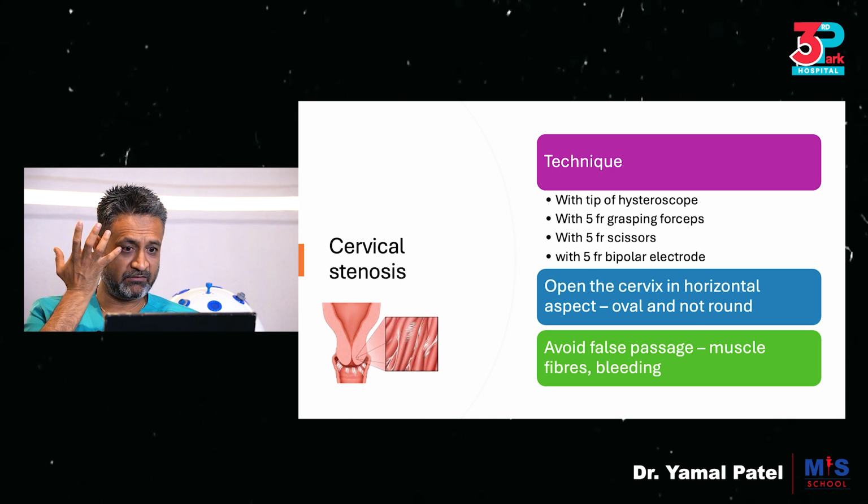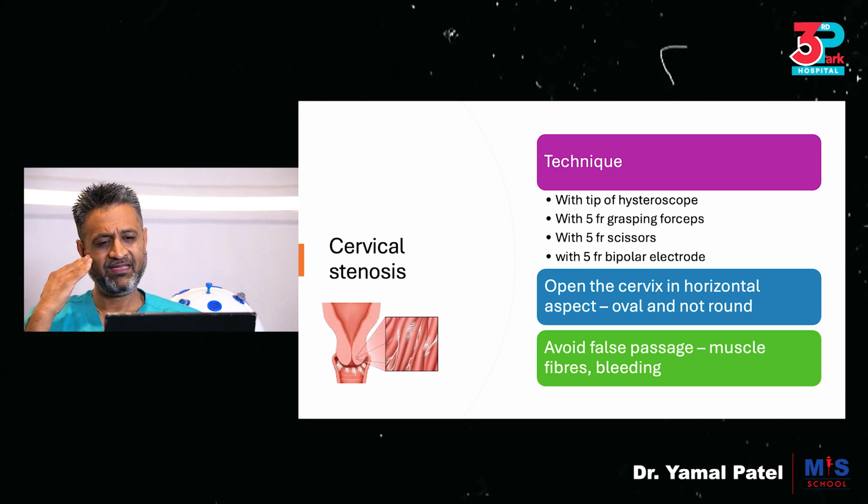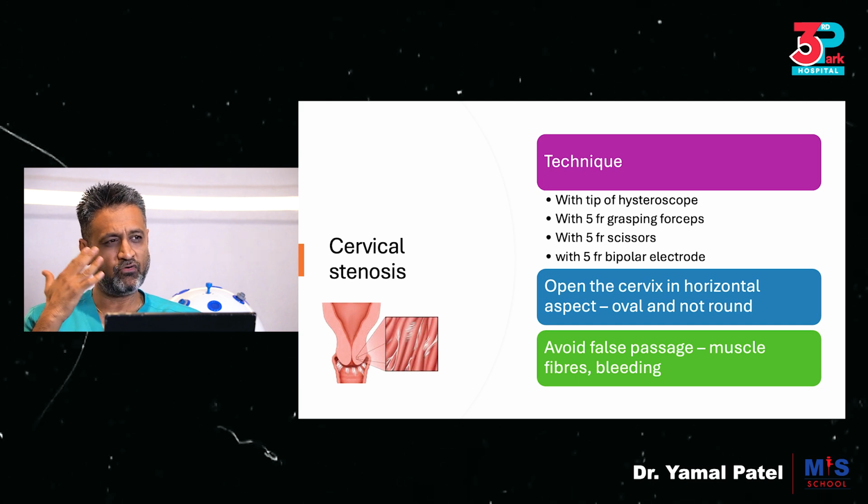Try avoiding a false passage, keeping in mind that when you go into muscle fibers, they'll be bleeding, and then you know you're in the wrong plane. So follow the guide from the hysteroscope and under vision, use any of these techniques to open up the cervical canal. Sometimes you may need to go in under ultrasound guidance as well to guide you on the way ahead.